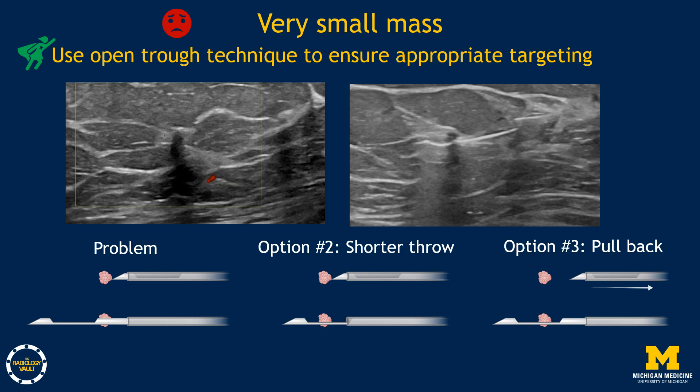Another tip: have the technologist hold the probe between samples to avoid losing sight of tiny masses after the first couple of passes.